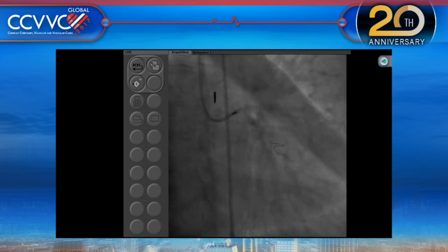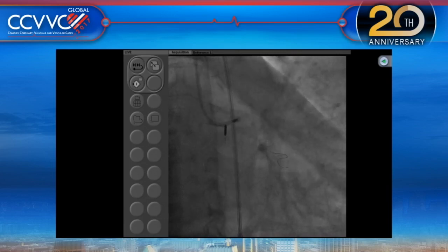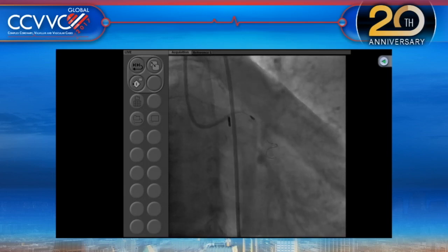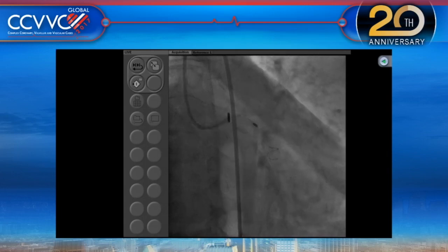But you have to not only have the wire backup, I often use a more durable microcatheter, like a Turnpike LP, which I've gone to more frequently, to spin through there and get through these high-grade stenoses, because without getting through, of course, I can't get a RotaWire in. And once I've done that, I don't usually have to use a 1.25 burr, because the diameter of that catheter would mitigate against using something smaller.